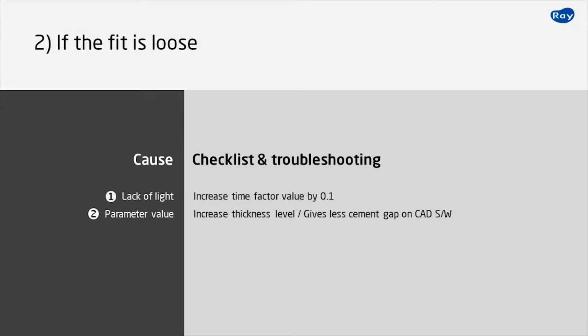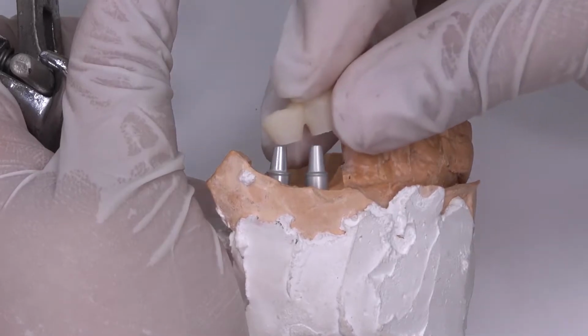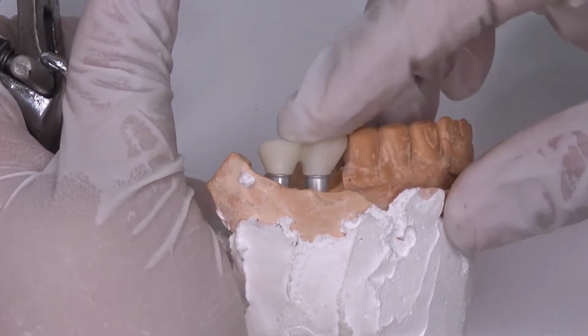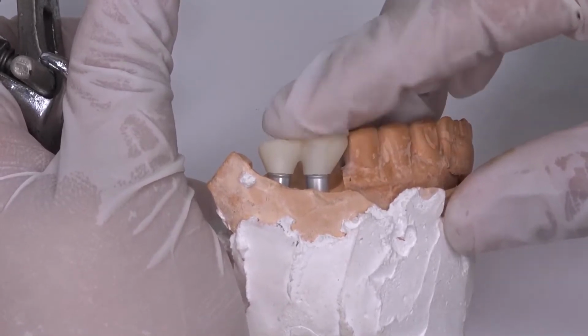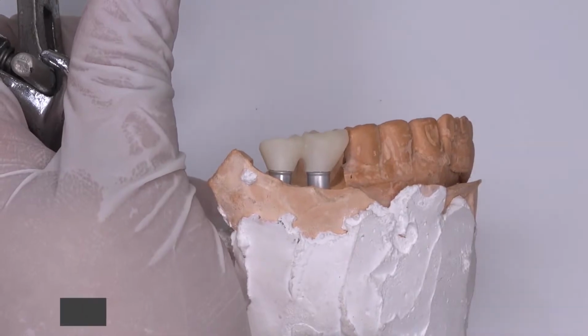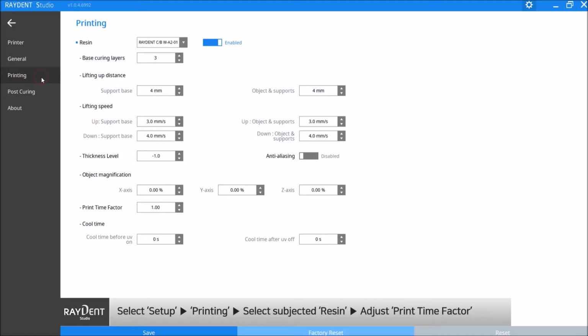If the fit is loose, adjust the time factor and parameter value. If the light power is low, the fit of the prosthesis may be loose, so we recommend adjusting the time factor value. More light curing time gives more print shrinkage accordingly. In the studio, click Setup on the upper right corner, select Printing on the left menu, select the resin you're using from the list, and add 0.1 to the current time factor value.